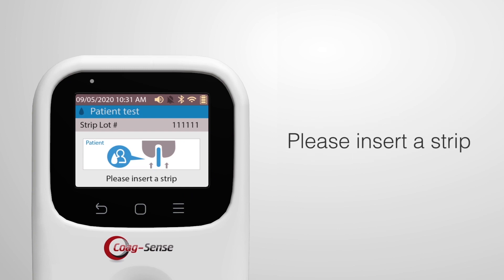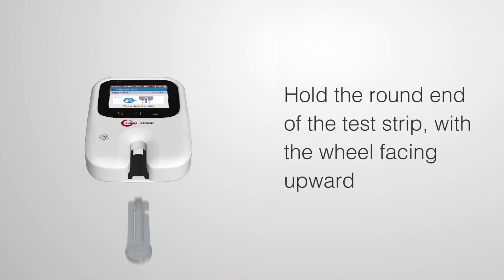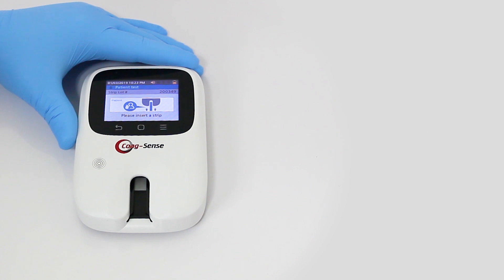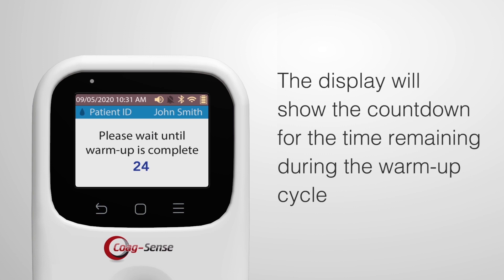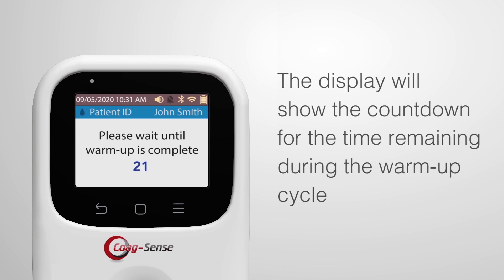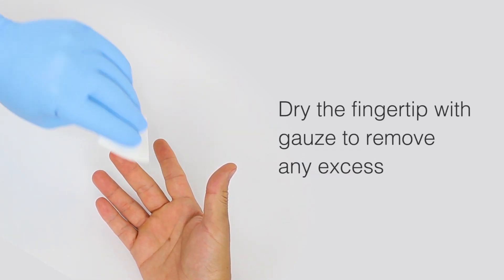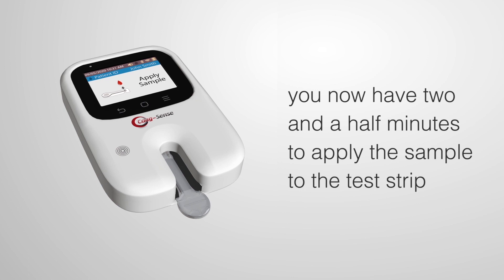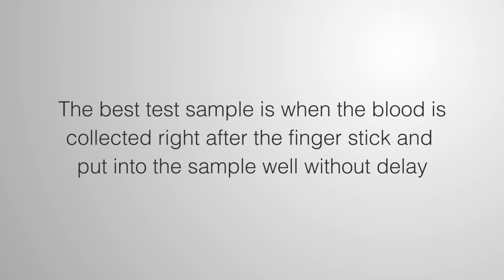The screen will display the message to please insert a strip. Hold the round end of the test strip with the wheel facing upward and gently insert the strip completely into the meter. The strip fits snugly and should be pushed all the way toward the back wall of the strip holder. The display will show the countdown of time remaining during the warm-up cycle. Clean the patient's fingertip with an alcohol wipe and dry it with gauze to remove any excess. After 'Apply sample' is displayed, you have two and a half minutes to apply the sample to the strip.